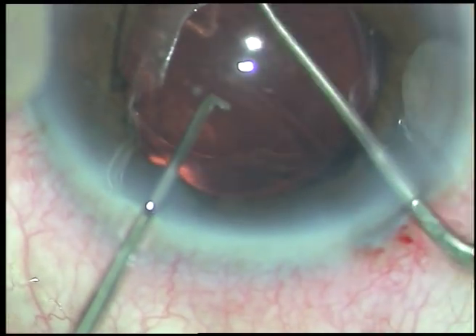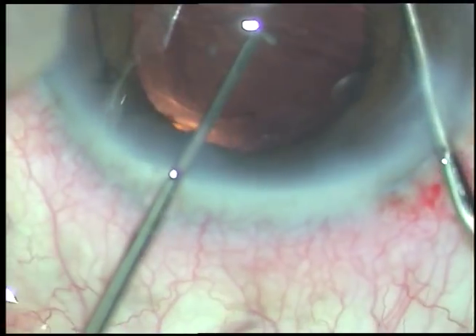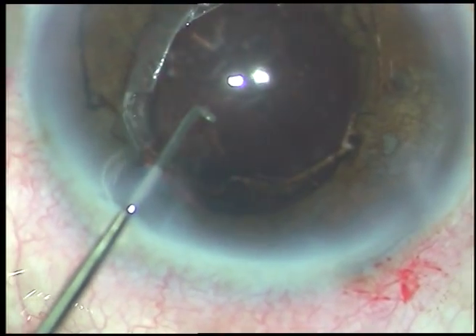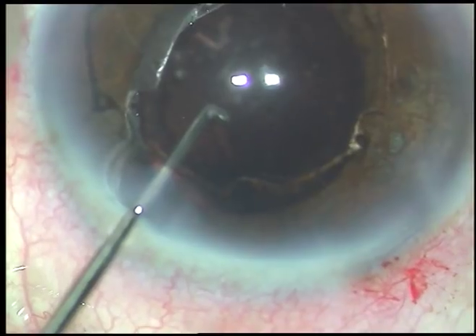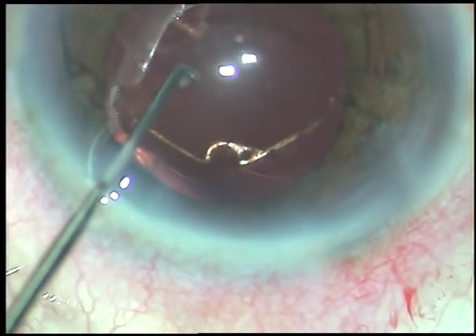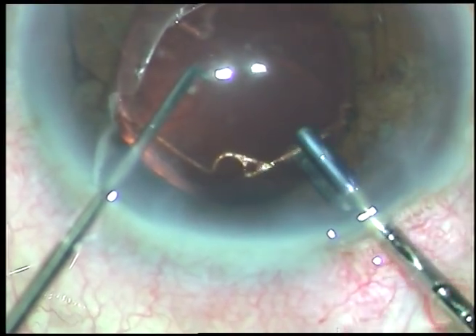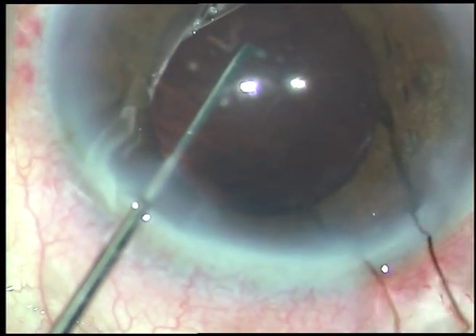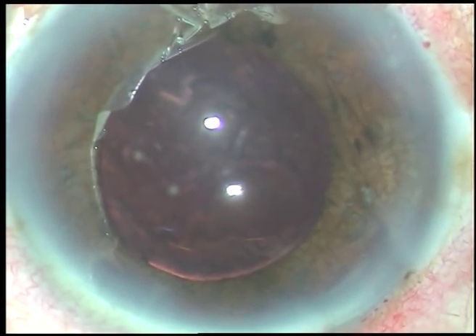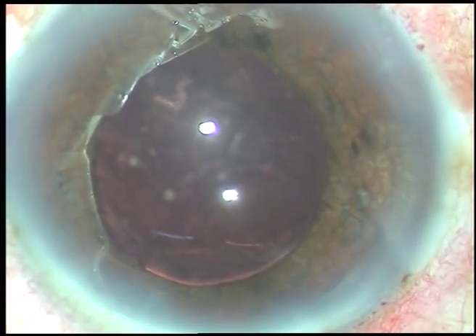Now I am untucking the flanges just with the Sinskey hook, and all the flanges have come out — it is now in front of the iris. Now I hold this Bhex hexagonal device with the 23G crocodile forceps and gently pull it out. See how easy the Bhex device is to implant and explant — to put in and to remove.